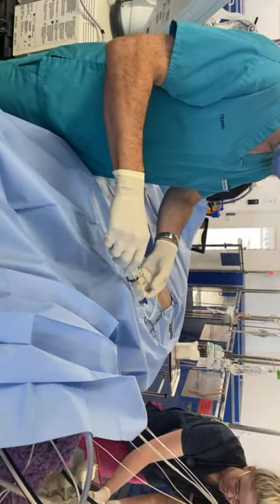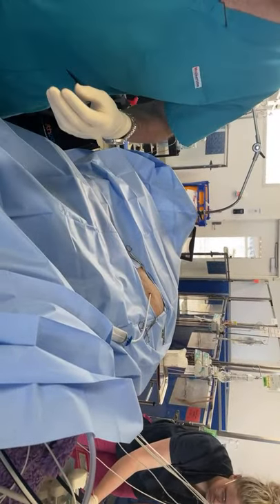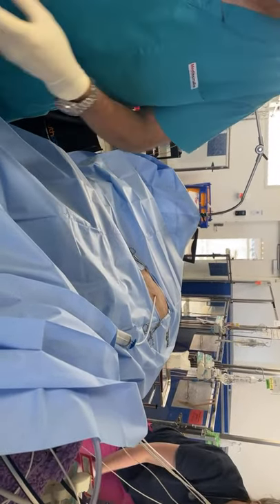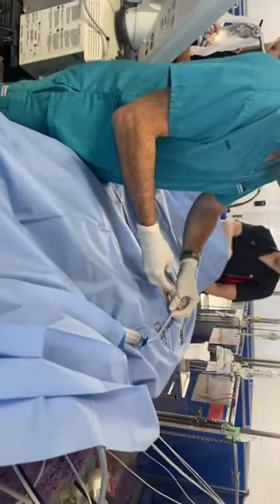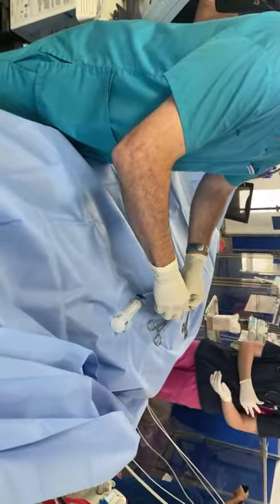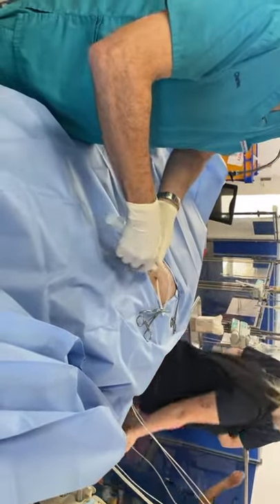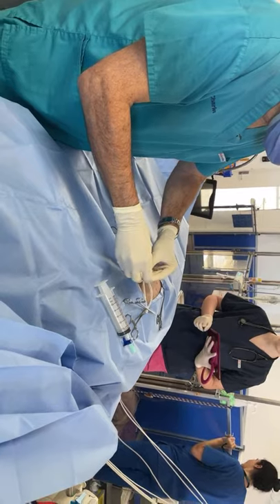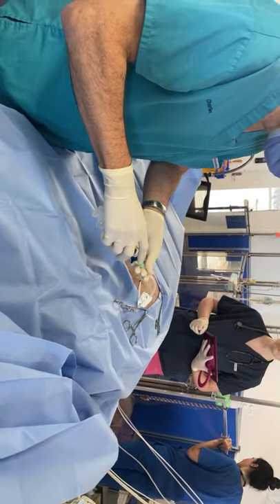I've turned it off to the patient and I'm going to get some white clip here. If you're going to use an instrument to clamp off the chest tube, don't clamp it directly — that can create a hole in it. Instead, fold it over and use the hemostat like that, which clamps it nicely without damaging the tube.